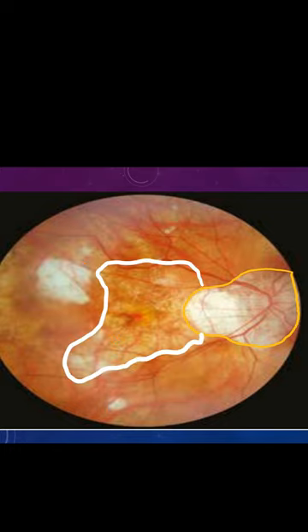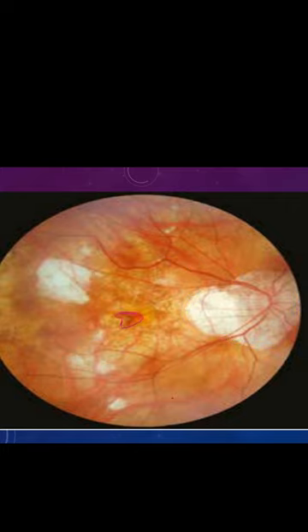Then we can see these macular degenerative changes, which are very common in the myopes. Then we can see this reddish lesion which is present in the center of the macula, which is probably a submacular hemorrhage.